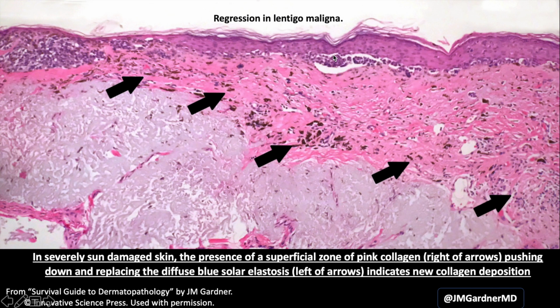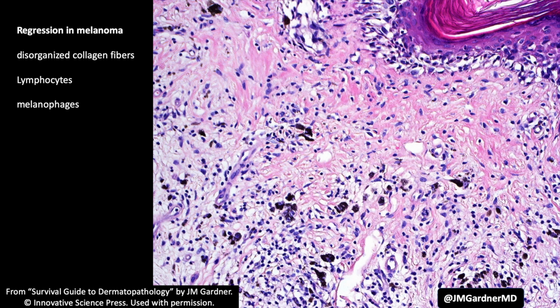That's melanoma until proven otherwise. That's a really good clue. It only works in old sun-damaged skin. If you don't have a bunch of elastosis, this trick doesn't work, but it's a really helpful trick in older sun-damaged patients.